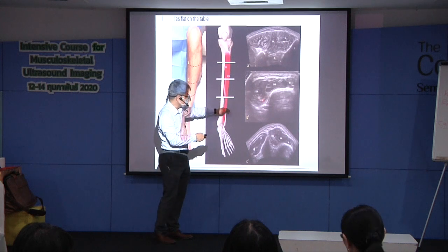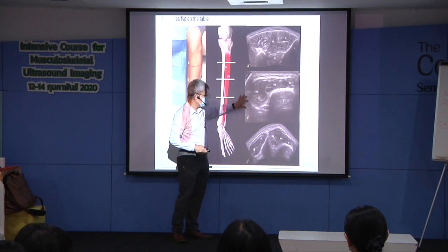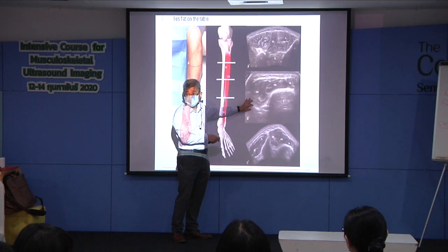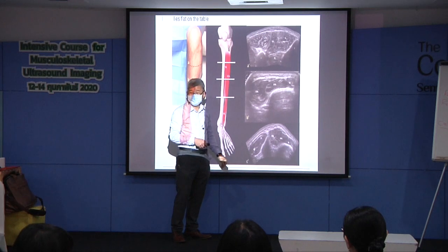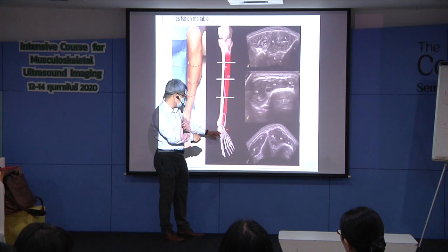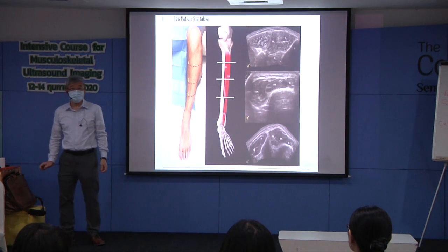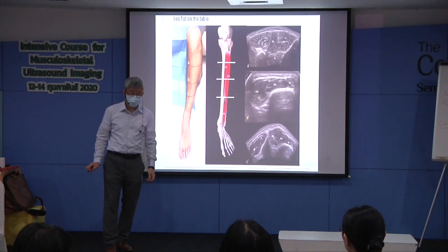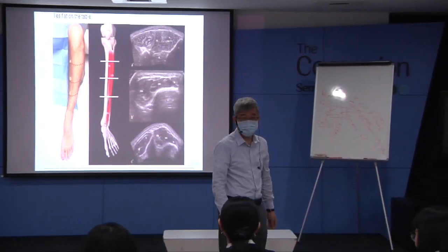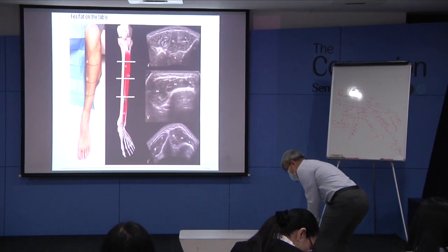Then we look at the extensor digitorum longus. Extensor digitorum longus is very easy to identify because here is the location of the fibula. If you look at the fibula and then you move forward, this is extensor digitorum longus. We move everything from the top to the bottom and to the end and look at the tendon. I'm going to use this table to do the demonstration, and the Mahito staff will help you to practice. Any questions? No? Good. I know you are confused. You will be more confused 10 minutes after. I guarantee you.